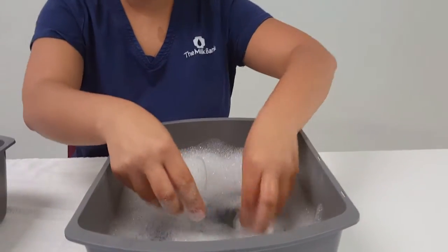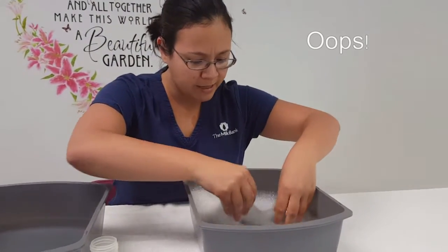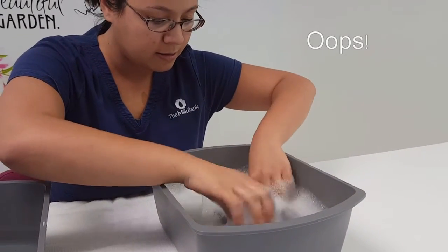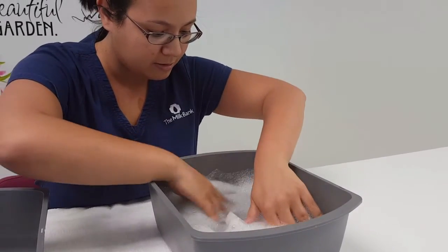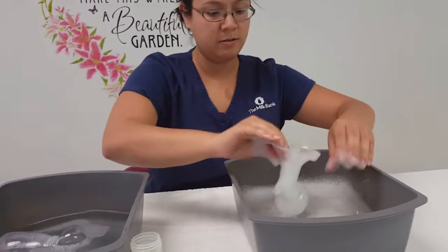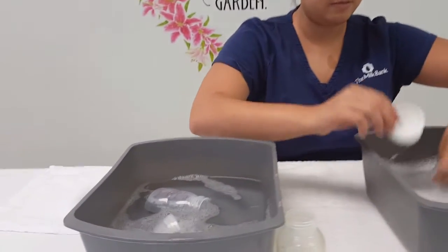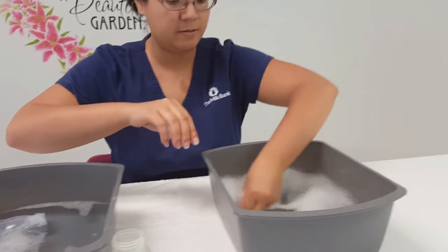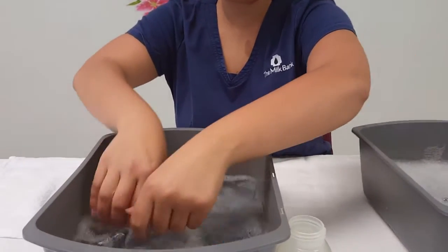And get my extra pieces washed. And where's my little white guy? I lost him. See, that's why I use the bucket, everybody. You did lose it. There it is. Make sure I get that washed. And then just rinse it.